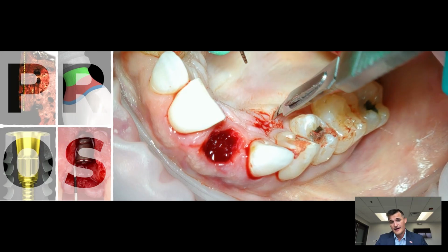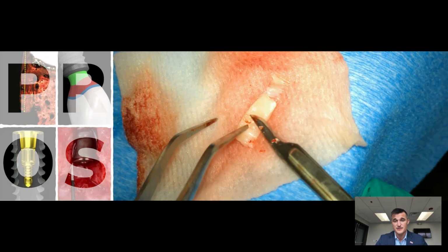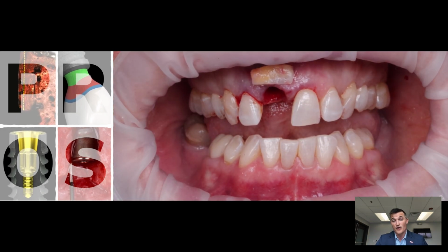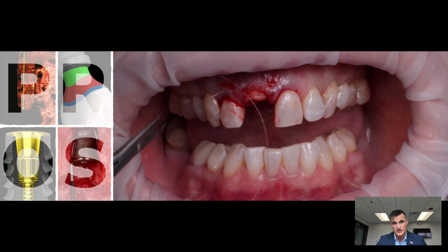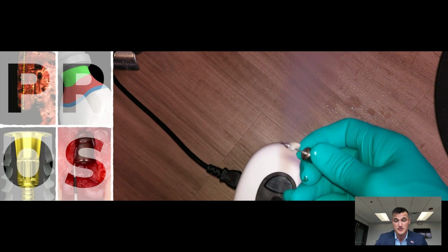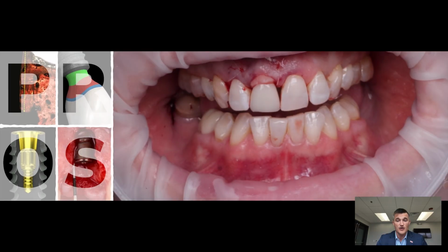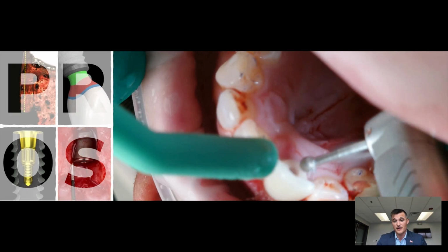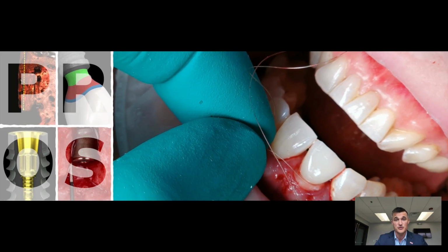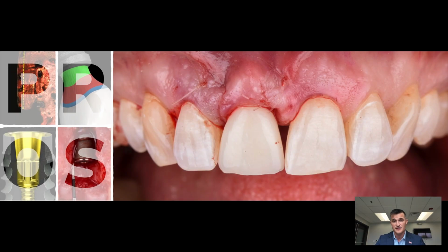This patient had some ankylosis of the buccal plate, so we ended up opting for socket shielding in this case. There was a recession, just a very small one, but it was enough that I wanted to correct that mucosal margin. So we're doing margin reestablishment therapy, as discussed by Jonathan Esquivel, having an under-contoured transitional prosthesis where we can increase the mucosal margin by about 2 millimeters during this healing phase. We're coronally advancing our tissues with autogenous grafting.